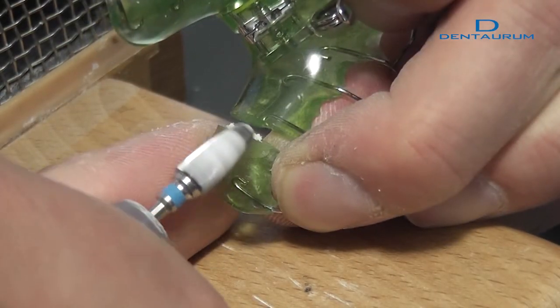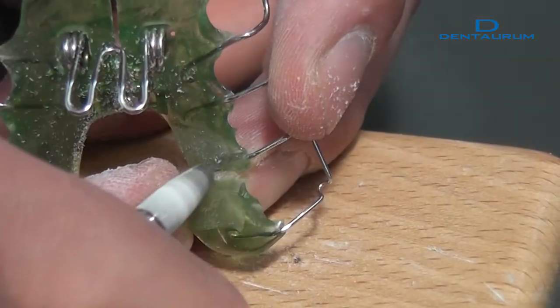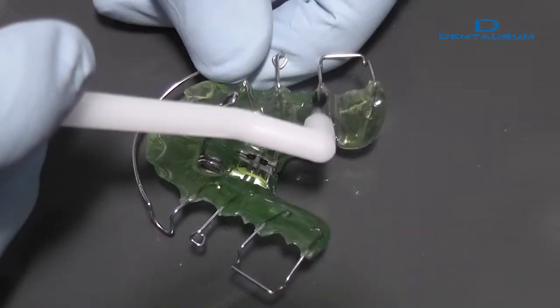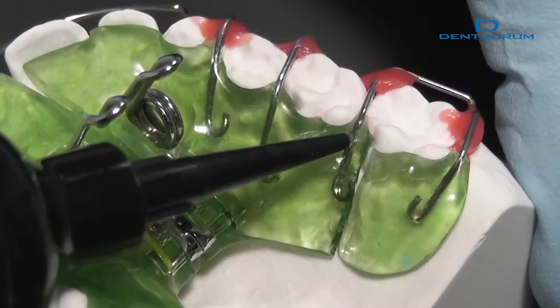A bonding agent can be used to repair PMMA with OrthoKryl LC. Roughen the area concerned and remove any grinding dust. Work the bonding agent as per the manufacturer's instructions and then apply OrthoKryl LC.